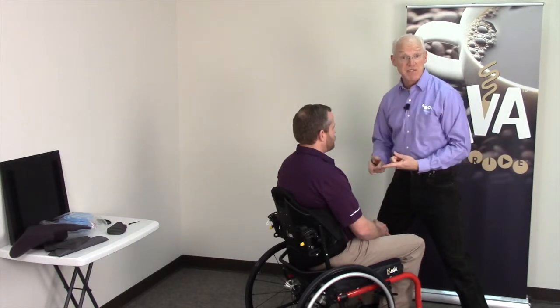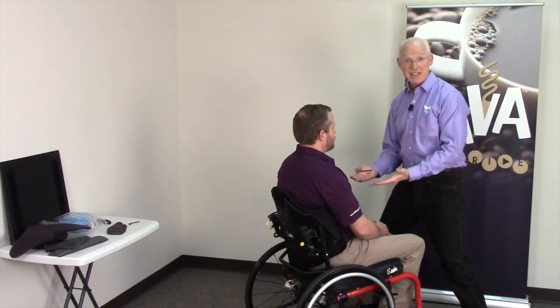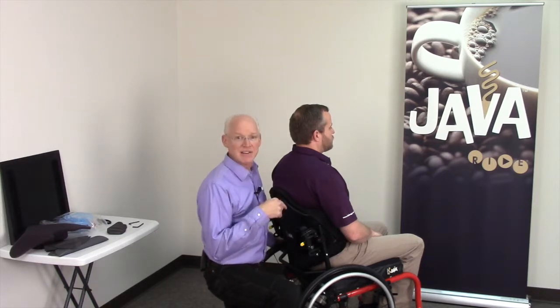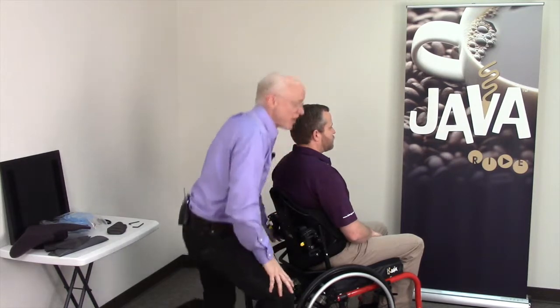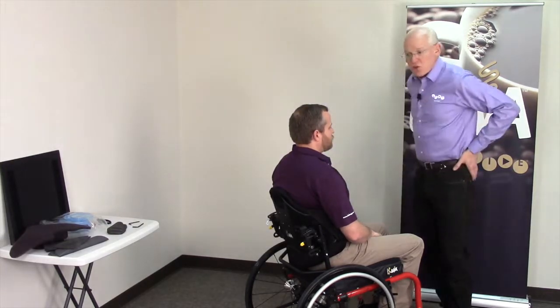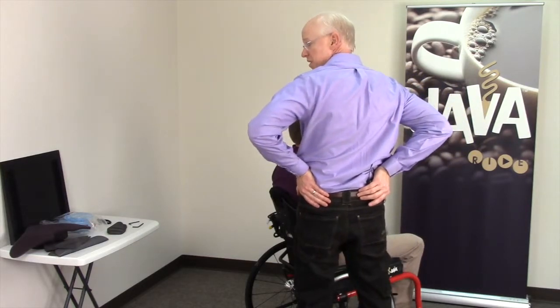I'd go through that fitting of the cushion, right? Trochanters, coccyx, sacrum, perineum, ITs. Finish my cushion fitting. So there's still more you can do. Typically, you've nailed it right here. But another thing that we can do is, once we've got him comfortable, I can make sure that I'm providing good support posterior and lateral to the pelvis.